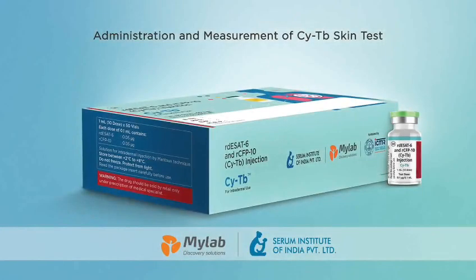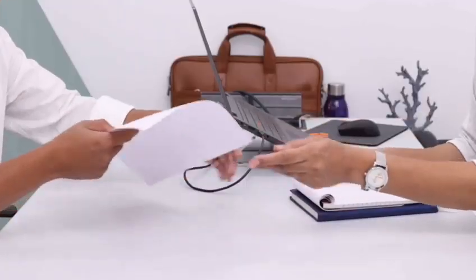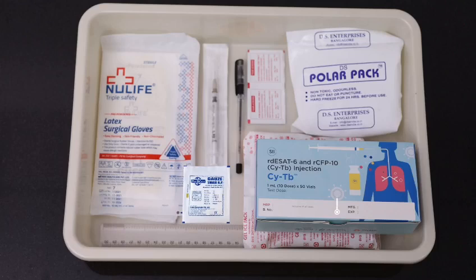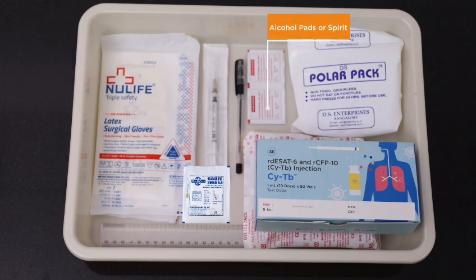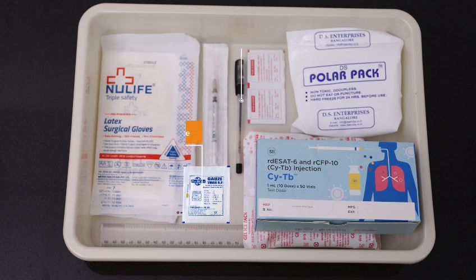We will be demonstrating administration and measurement of SciTB skin test. Explain the procedure and take the required consent. Material needed for the procedure are a 10-dose vial of SciTB, sterile gloves, alcohol pads or spirit, 1 ml graduated disposable syringe, 26 gauge needle or suitable needle for intradermal injection, sterile gauze, ballpoint pen and a scale for measurement.